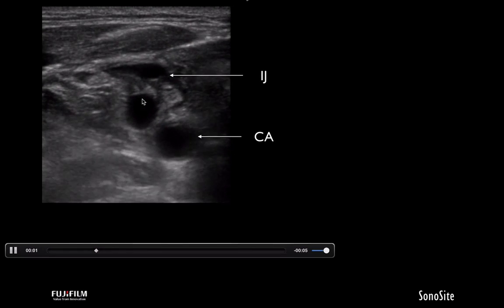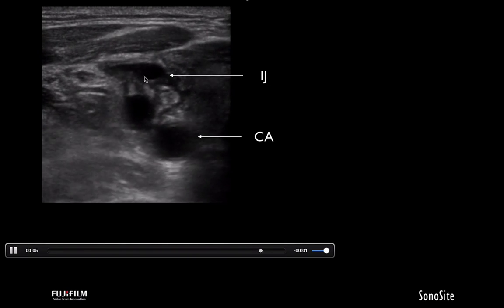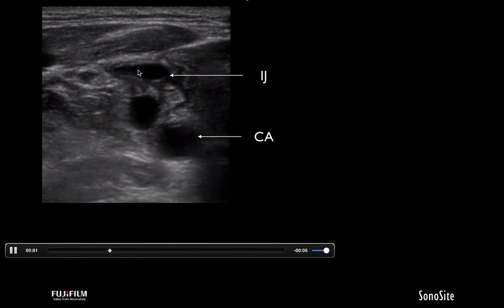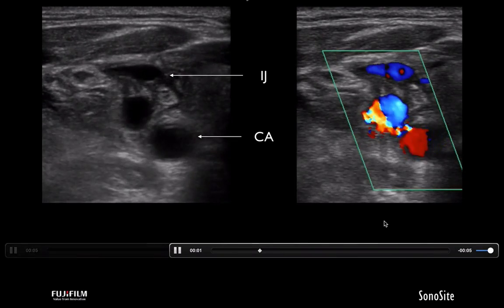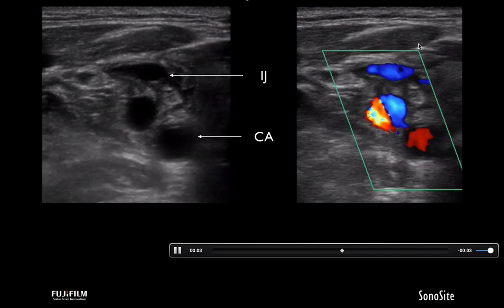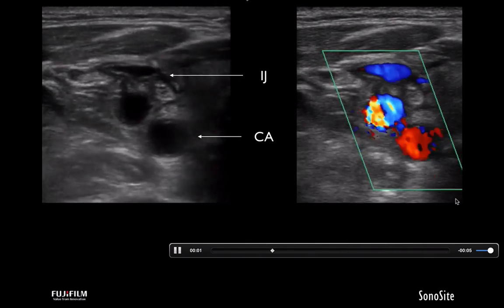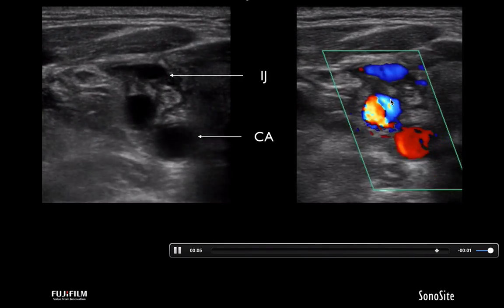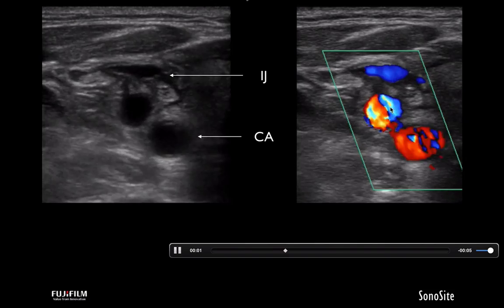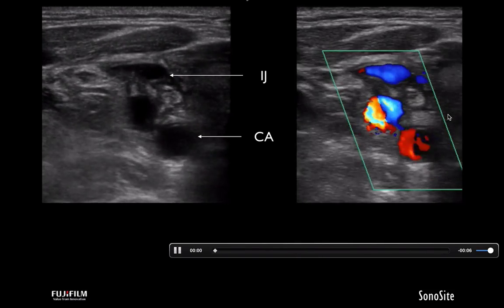And you can see, what's this? And so this patient had a cannulation performed, and the provider went through this flat IJ and into the carotid and actually formed an AV fistula. You can see this. This is a Doppler box, which is incorrectly placed. It should be more vertical. It should be straight up and down, but that's fine. Still gets a point that this is abnormal, and this is classic for AV fistula. You have this thing called the yin-yang sign of a pseudoaneurysm, but this is clearly just a fistula.